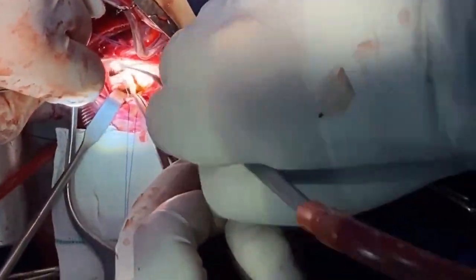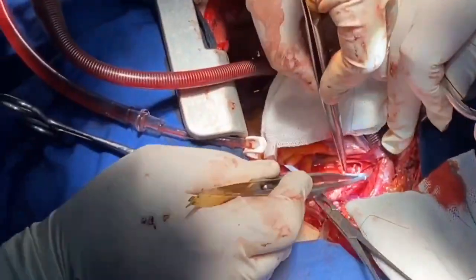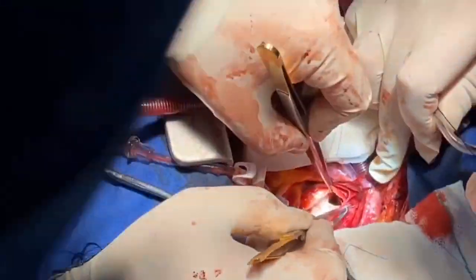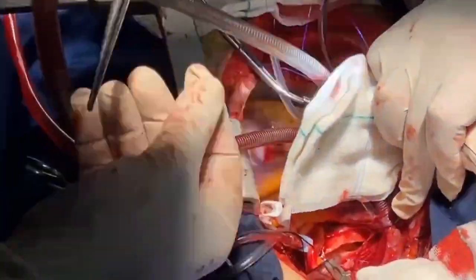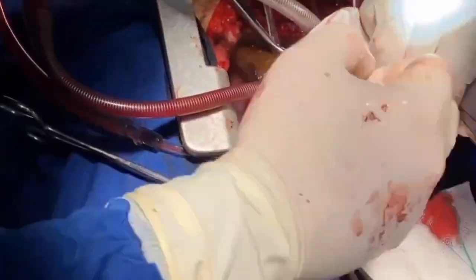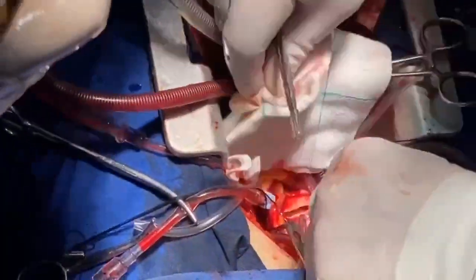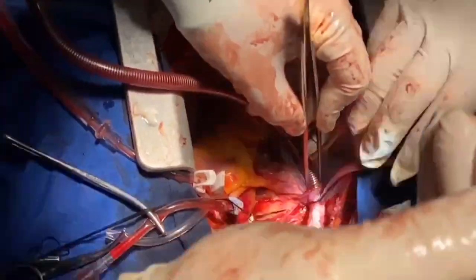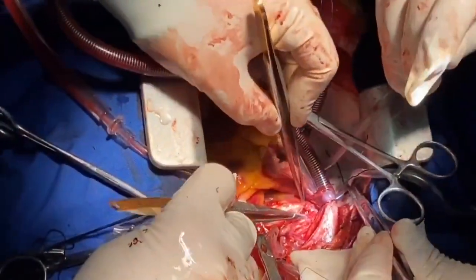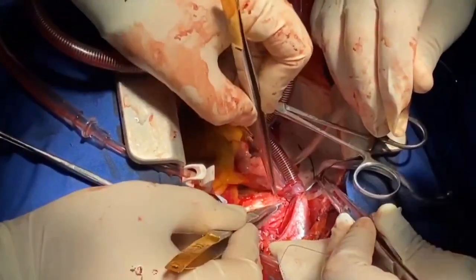While opening the main pulmonary artery as well as the right pulmonary artery, you have to find a true plane in order to dissect with a Jamieson dissector, with simultaneous suctioning of clot and overlying materials. After doing so, you have to be sure about the completeness of your endarterectomy with an angioscope, then close the right as well as main pulmonary artery stitches.